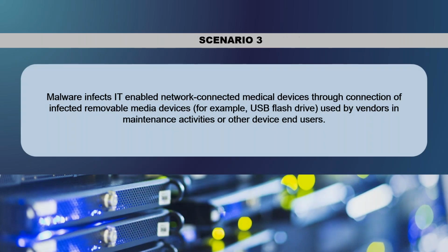Okay, so this one involved malware infecting a network-connected medical device. Basically the gist of this one was that a medical device was infected by a removable media device like a USB, because the vendor said that they needed access to do maintenance. This is something you always have to probe, especially with a vendor. If you do need a USB to do any patching, you should always implement a scanning solution for the USB. It should never touch any medical device before someone from healthcare or IT evaluates it to make sure there are no viruses.